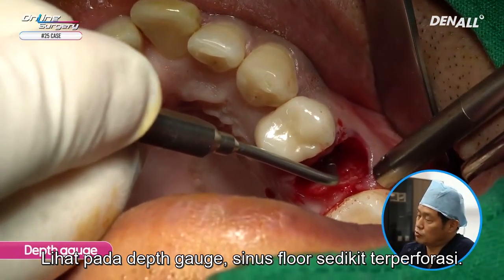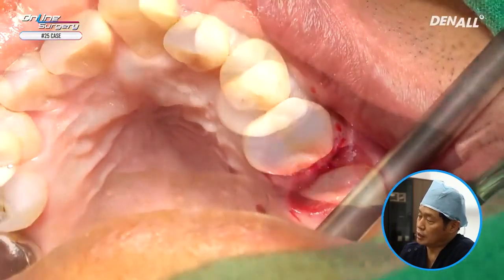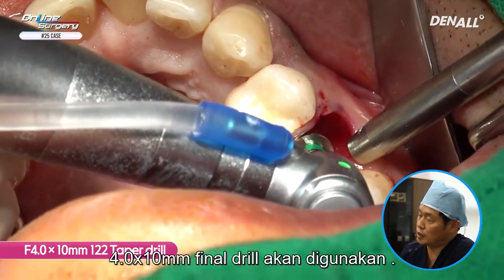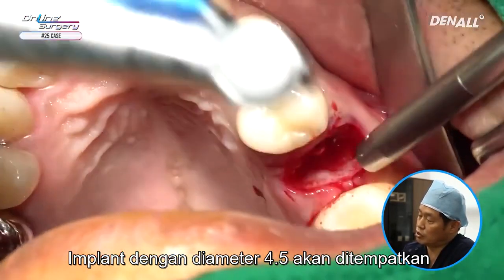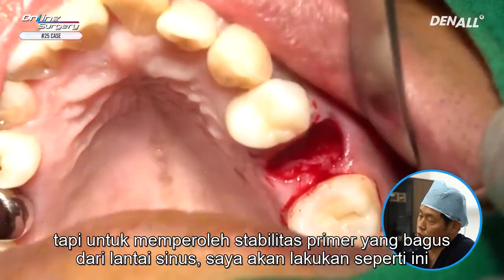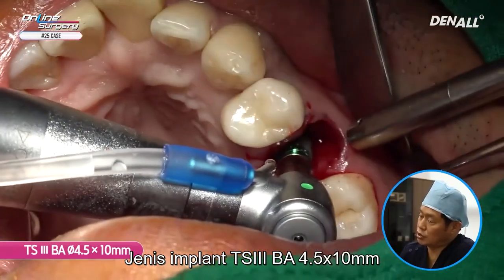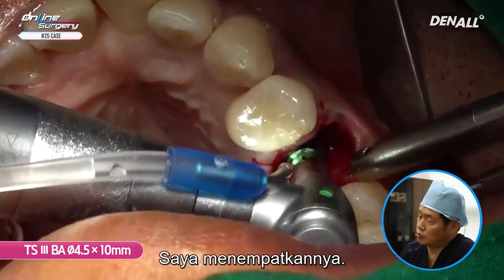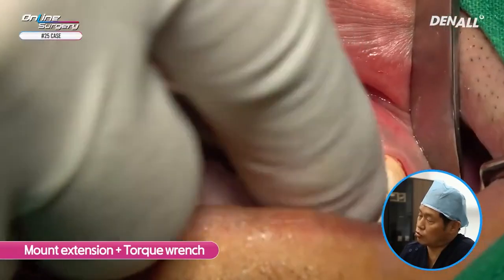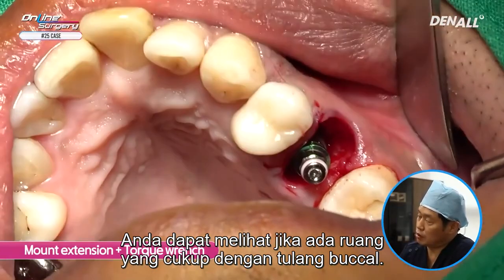Looking at depth gauge, sinus floor is slightly penetrated. This has been confirmed. 4.0 by 10 millimeter final drill is going to be used. The 4.5 diameter implant is going to be placed, but to get good primary stability from the sinus floor, I'm going to do like this. The implant is TS3BA 4.5 by 10 millimeter implant. I'm placing it. It's slightly palatally inclined, as clearly shown. You can see that there's sufficient space with the buccal bone.